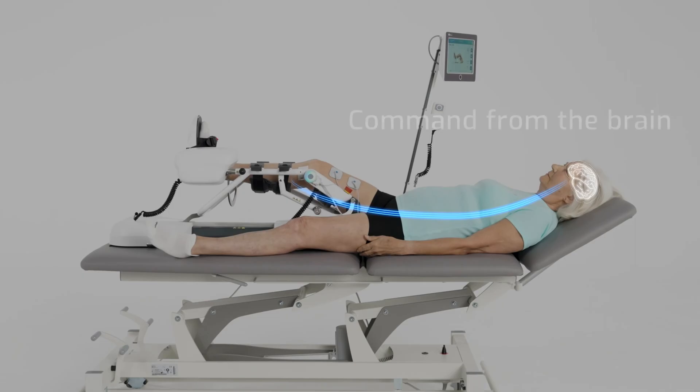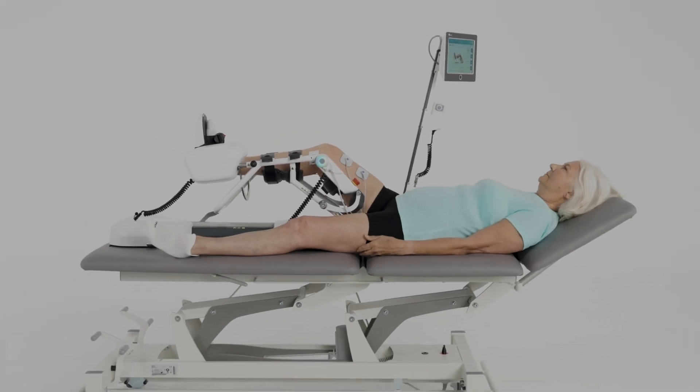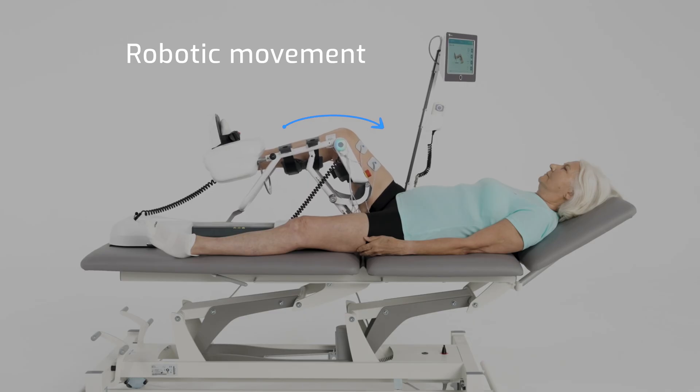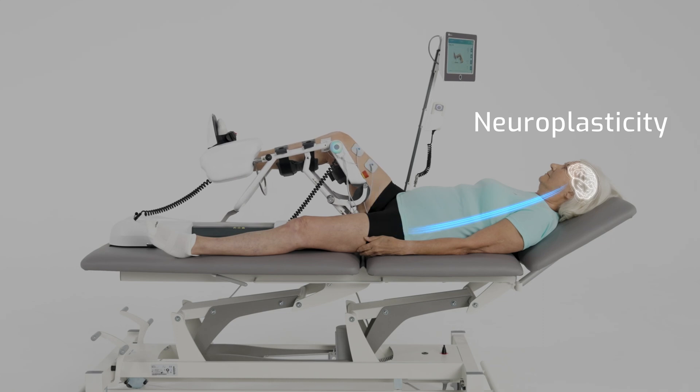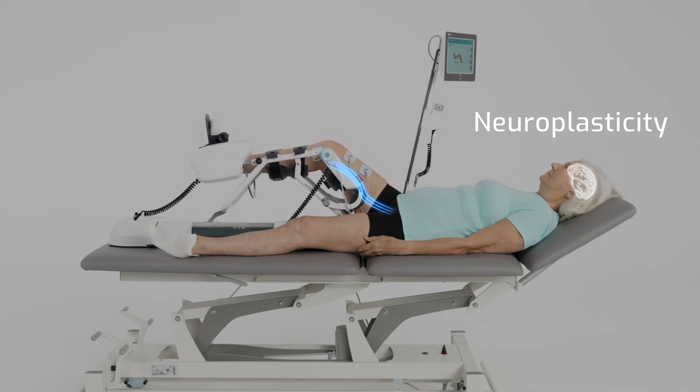When the brain activates specific muscles via motor neurons, Sidralec detects this small activity, triggers functional electrical stimulation and response, and initiates robotic movement in the correct pattern. The whole process affects neuroplasticity and leads to the recovery of lower limb function.